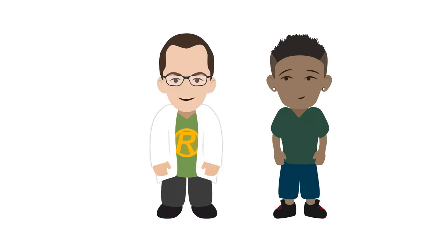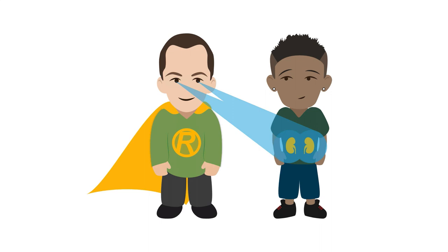I like to think of the narrow liver window as x-ray vision for radiologists, as it helps you to see abnormalities that are nearly invisible at first glance. Now that we have covered window width, let's discuss window level.